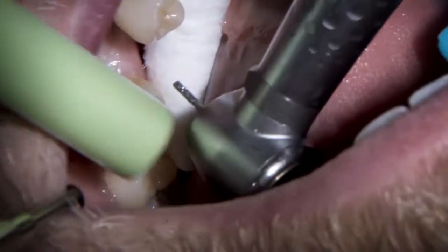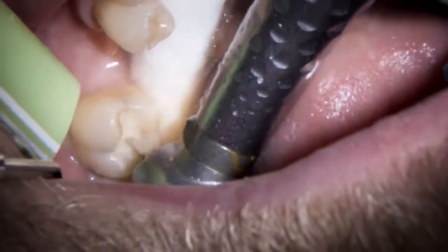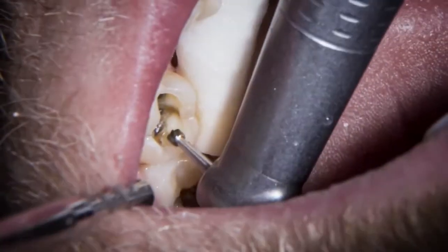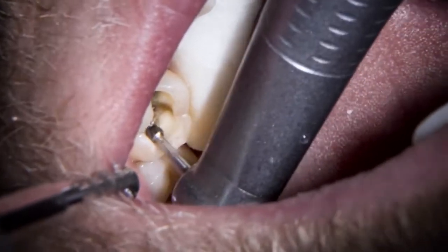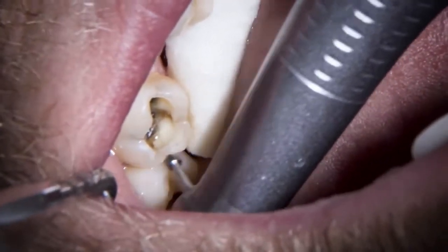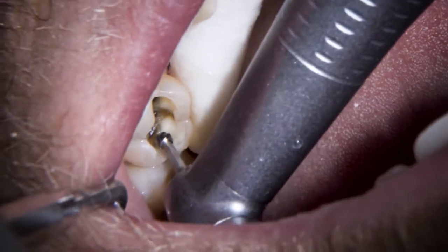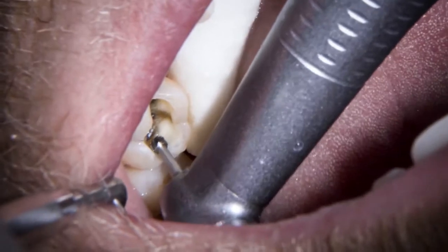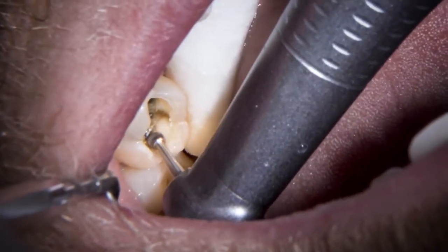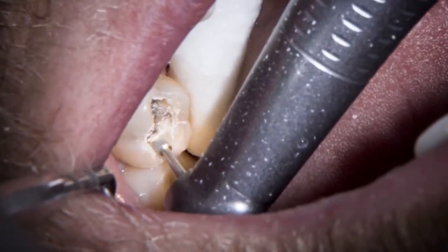In this distal area, we can often find that it goes all the way through to almost a little distal cavity. I don't think it will in this case, but if it was, using biodentine I'd always try to maintain the marginal ridge — not necessarily a tunnel prep, but clear it all out. Having biodentine in there means that cavity is not going to progress from the outer surface. Almost like the old-style tunnel preps — if it had gone almost to the enamel surface, I'd still try to keep that intact and just get biodentine in there.